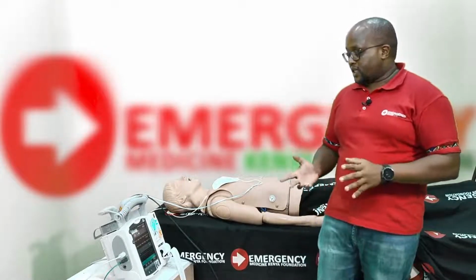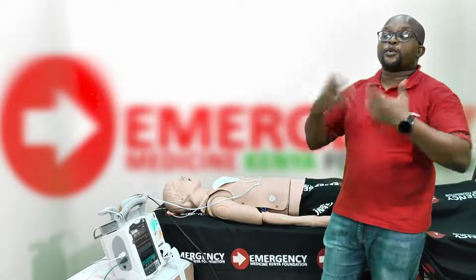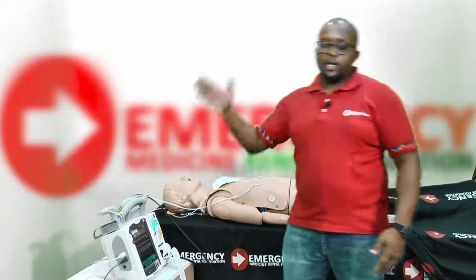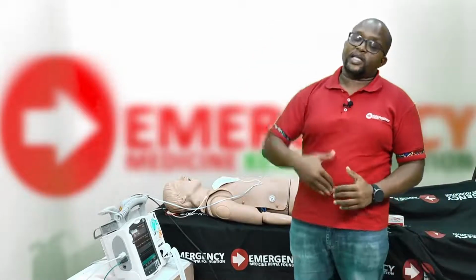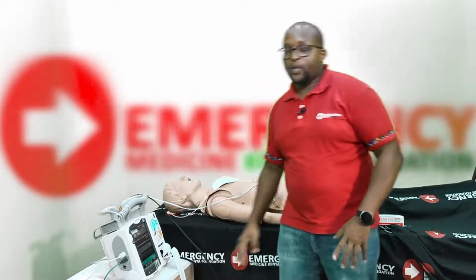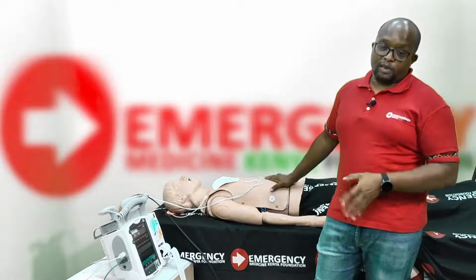The difference is, if a patient's initial heart rate was 38, and the patient's heart rate improves by itself and you're on demand mode, the machine will go on to standby mode, waiting for the patient's heart rate to go below what you had set, which is 70 beats per minute. I repeat that again. Currently, we are pacing the patient at 70 beats per minute.